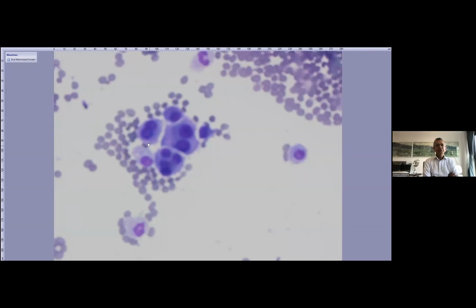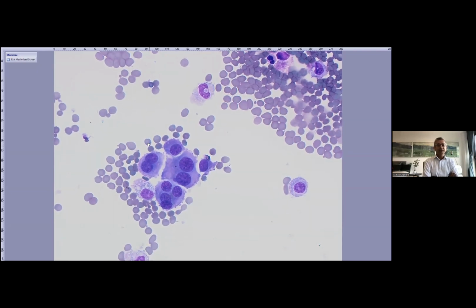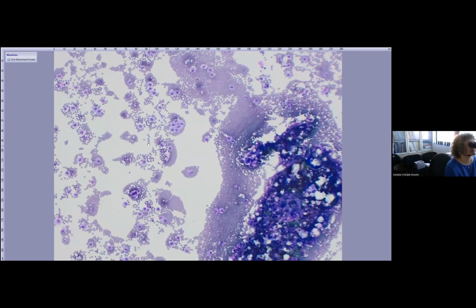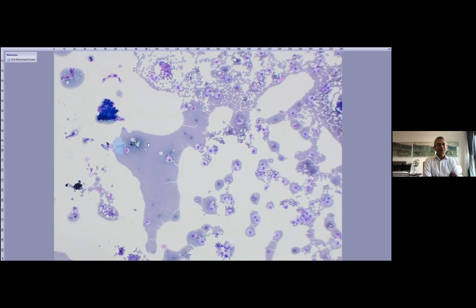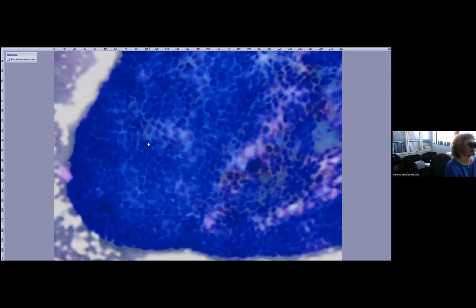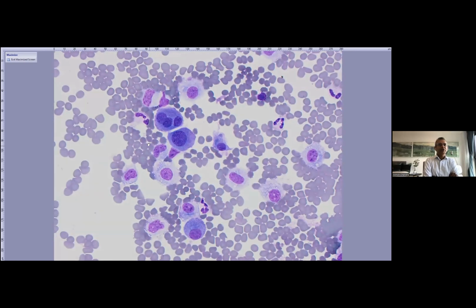And I would say to the trainees and exam-going candidates to just, in your mind, run through the features of mesothelial cells: basophilic cells with a two-tone cytoplasm, with gaps or windows between cells. The overall NC ratio is low, the nucleus is central, very monomorphic appearing.